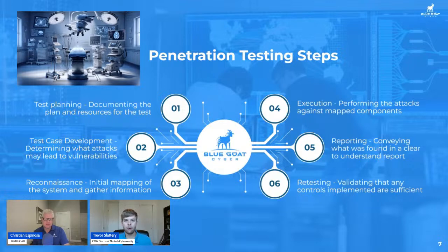So before performing the actual exploits, we want to gather as much information as we can about the device. Under the medical device context, this is often going to be a white box approach. And what that means is that we're provisioned a lot of information, the source code with the device, lots of documentation around it. So we're gathering in all of this information to understand the device as much as we can and have some more targeted testing.